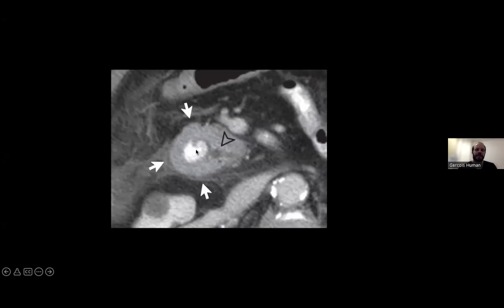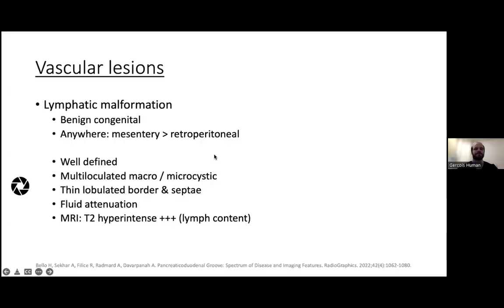This is not a pseudoaneurysm, or this is not the duodenum. The duodenum is actually on the inside. So this is an annular pancreas mimicking a thickened duodenum. And what we're also going to appreciate is the low signal, low density here, which is the CBD, the biliary duct.